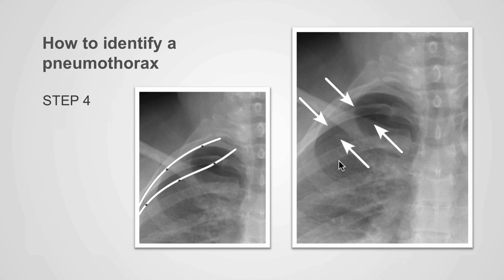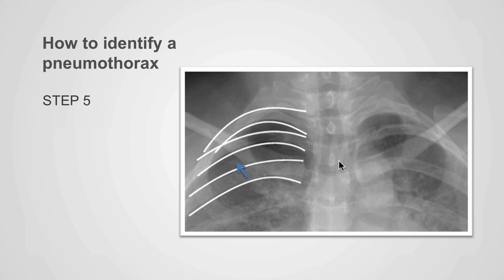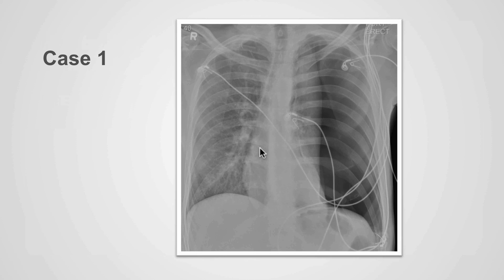If you're still having difficulties identifying the pneumothorax, then outline each of the ribs on the suspected side. This is the first rib, the second rib, the third rib — superior cortical outline, inferior cortical outline. Here is the superior cortical outline of the fourth rib and the inferior cortical outline of the fourth rib. Between the third and fourth rib, there is an additional line, and this is the edge of the pneumothorax.